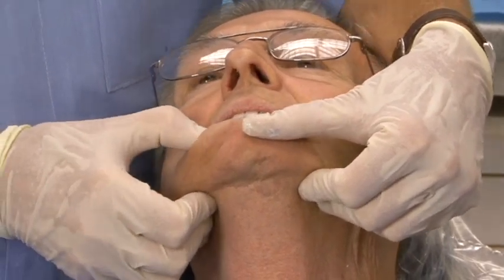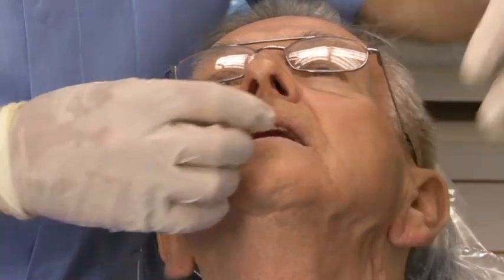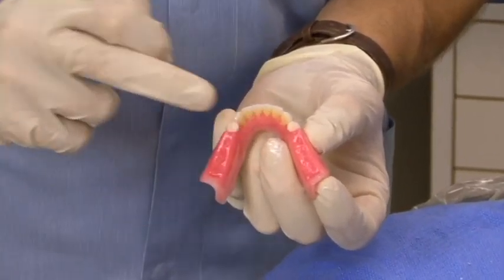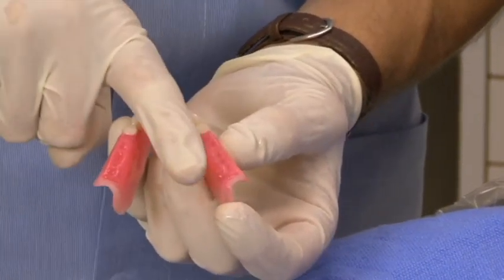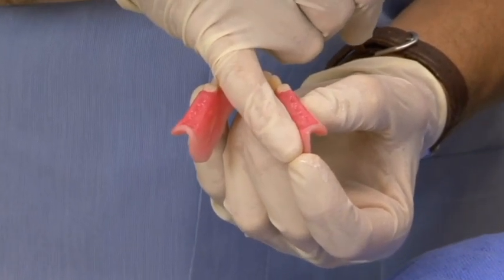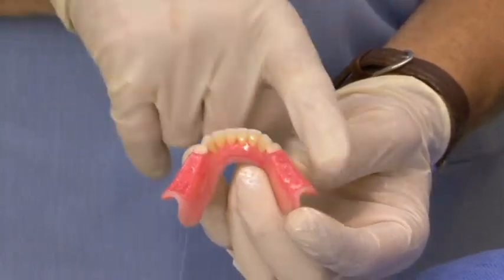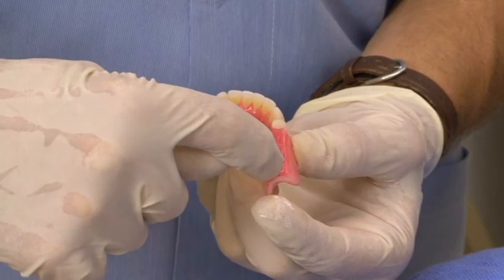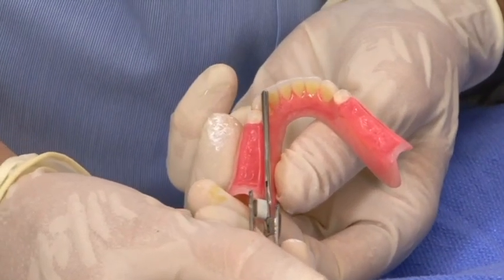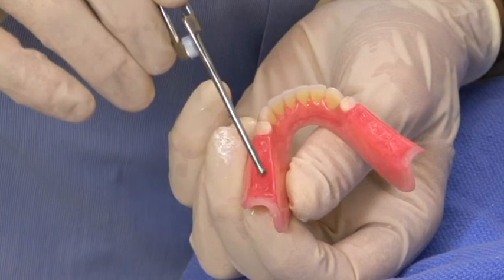As you can see, he's on his wax rims back here. In our wax rims, there are little indentations for the upper lingual cusp. The lingual control line goes from the canine back to the lingual of the retromolar pad, and from the mesial point angle of the canine to the buccal of the retromolar pad. It's that little triangle where the upper lingual cusps are set in — same thing on this side. That's where the lingual cusp of the upper teeth must go.